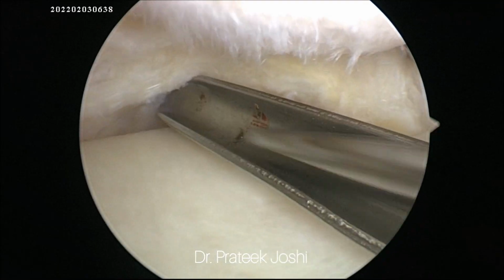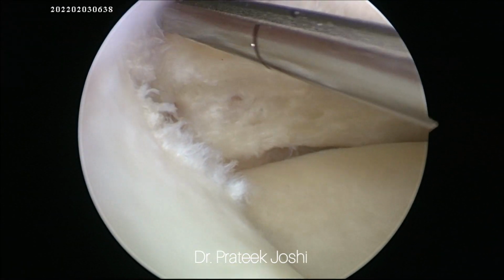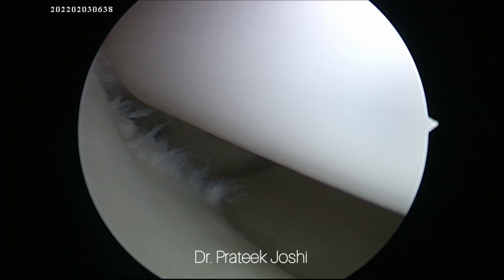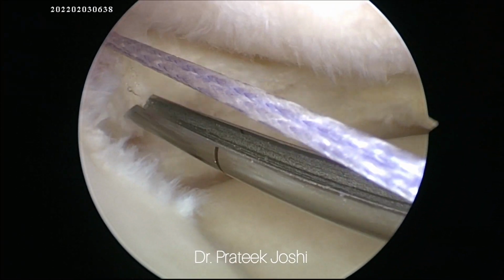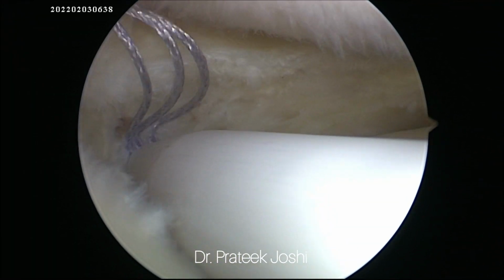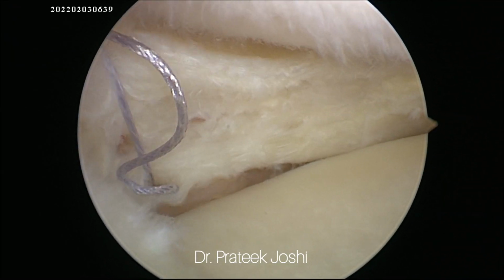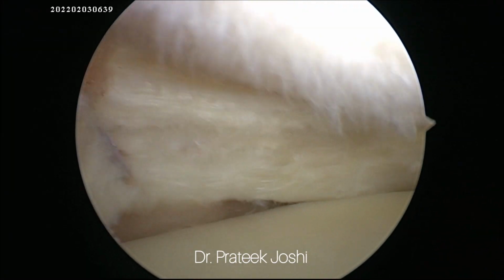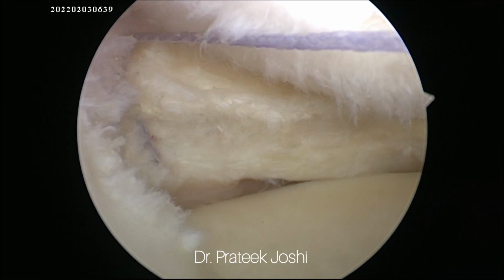So now I have introduced my all inside device from the anterolateral portal. I am going to take a bite from the anteriormost portion of the tear, and as I pierce the superior capsule with the help of the all inside device, I am going to deploy my first implant. And now I am going to pierce the inferior capsule, and I am going to deploy the implant. Both the implants have been deployed, and now I'm going to pull the suture to tighten the knot, and this completes our first suture. I'm going to cut my suture with the help of a knot cutter.